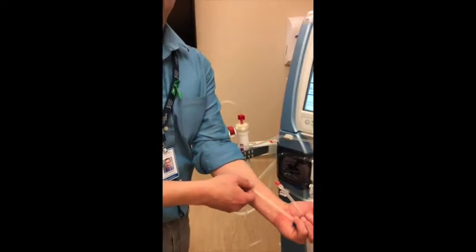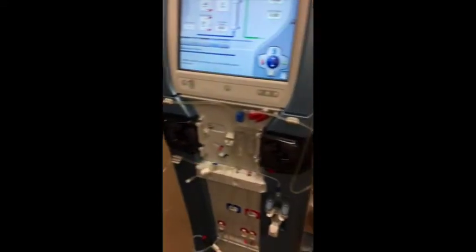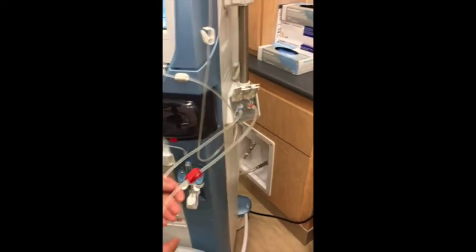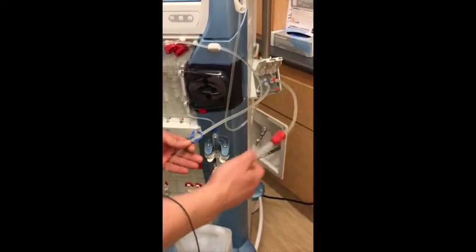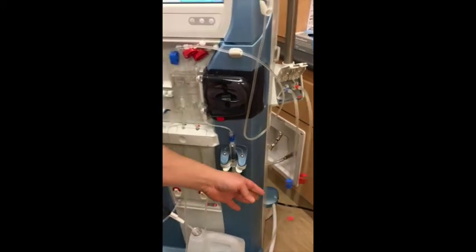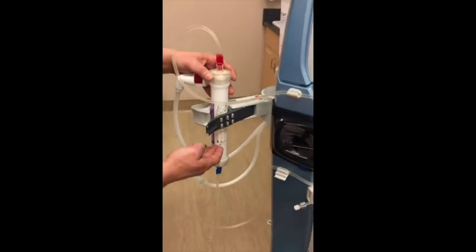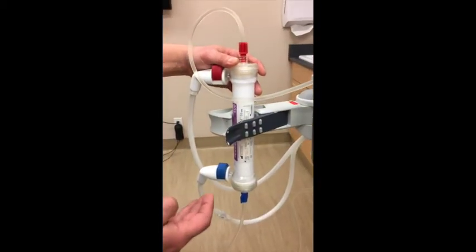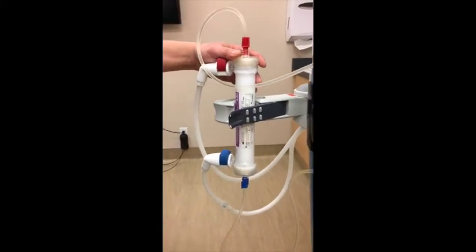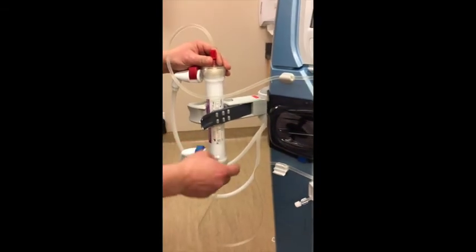The blood then passes through the venous line and some additional chambers, returning to the patient via the blue venous line. I'm going to explain now why we have some different colors — red and blue — and what they signify. We are mimicking the way we label things in the body: arterial red and venous blue. In the human body the heart is the center of the operation. In the dialysis circuit, the artificial kidney — the dialyzer — is the heart of the operation. So what we are doing is taking blood from the patient via the arterial line, delivering it to the artificial kidney where the filtering and cleaning occurs, and then returning it back to the patient via the blue venous line.